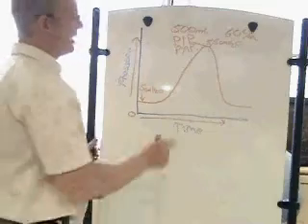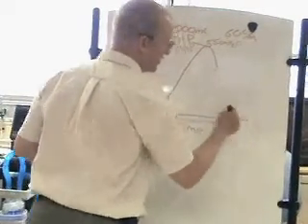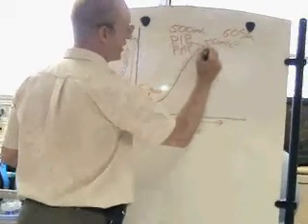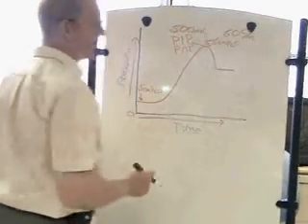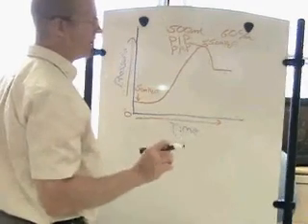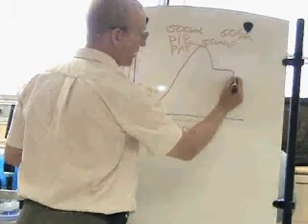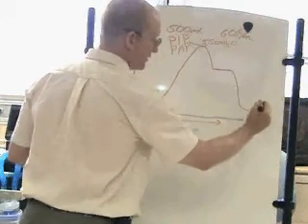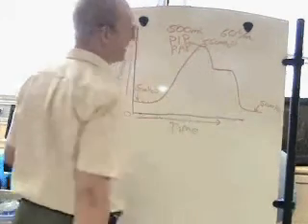To figure that out, you have to place an inspiratory pause on the patient's ventilator. And when you do that, you'll see that the pressure, after going up to a peak inspiratory pressure, will come down and hold at a horizontal line. This is known as your plateau pressure, and once again, it's taken by instituting an inspiratory pause on the ventilator. And then obviously when the inspiratory pause is done, that pressure will drop back down to the PEEP level. Okay? This pressure over here is still at 5 centimeters of pressure. So the PEEP level that you see over here is the same PEEP level over there.